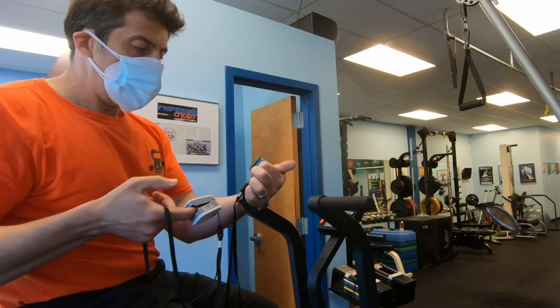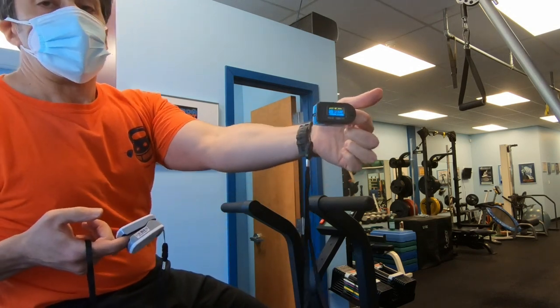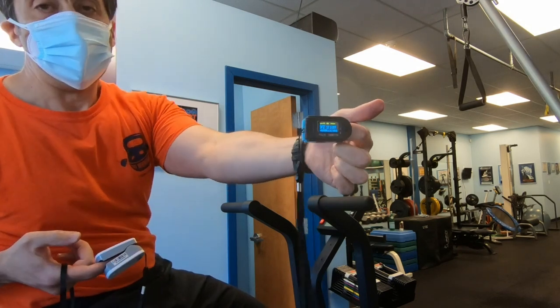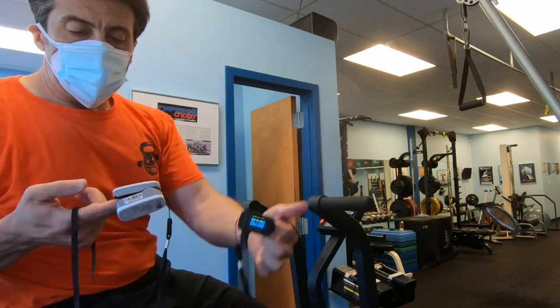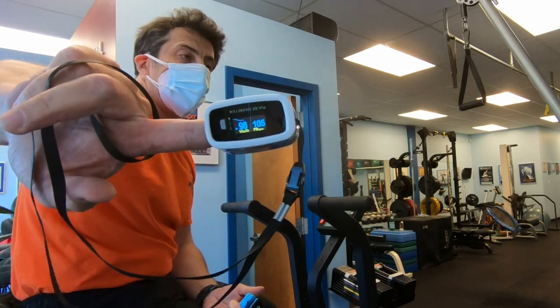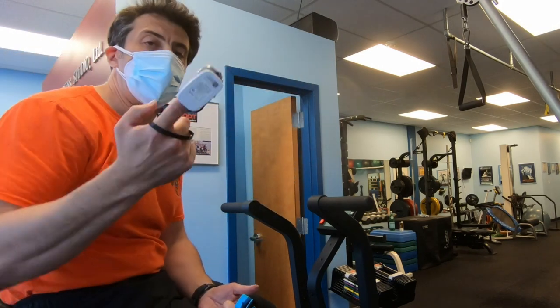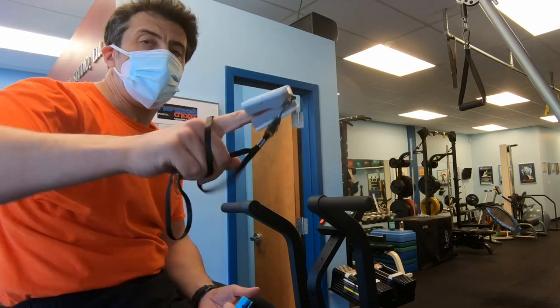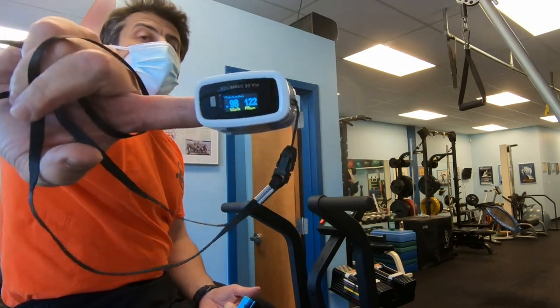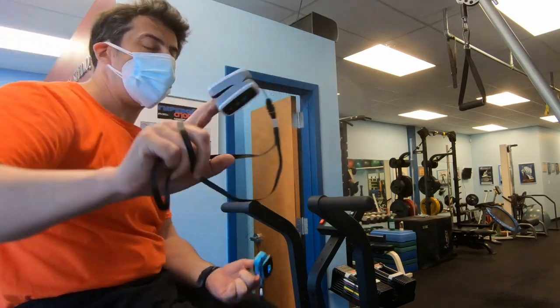Okay, my heart rate is 129. I'm breathing heavy, but you can see the oxygen level is still somewhere around 97-98. This one too, heart rate of 100, but oxygen saturation is still good, 98. So you don't get deprived of oxygen in your brain, nor your muscles.